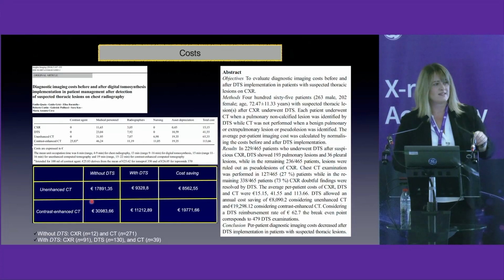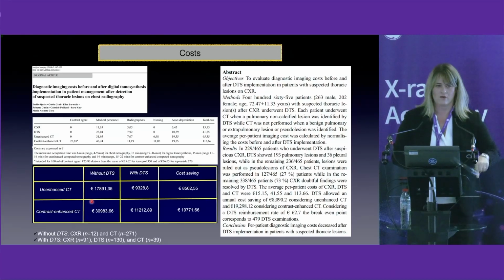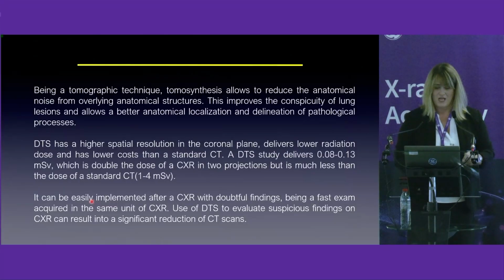If our techs say, oh, Elisa, come and see. I see something wrong with this patient. Can we perform DTS right now so the patient doesn't move? We can solve doubts directly in our department, immediately.